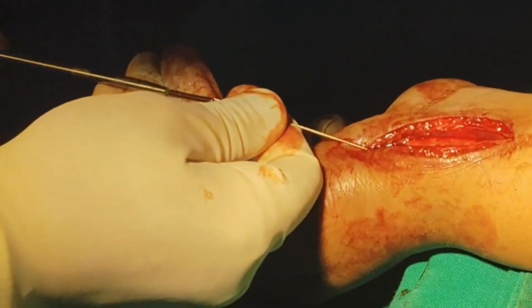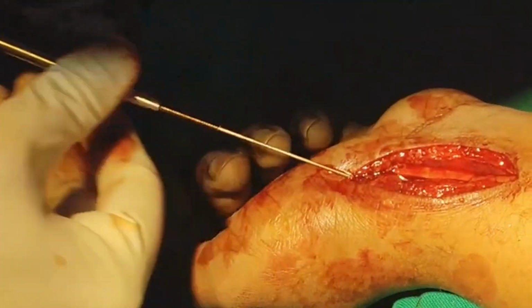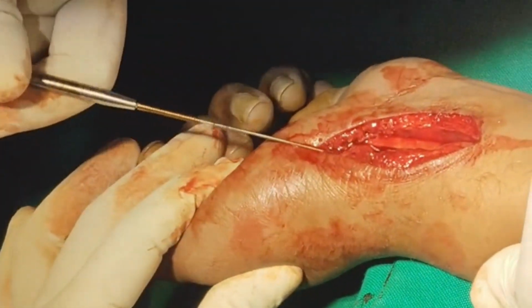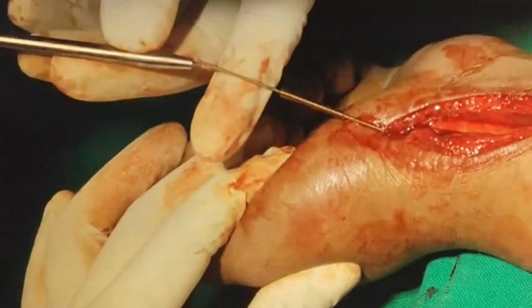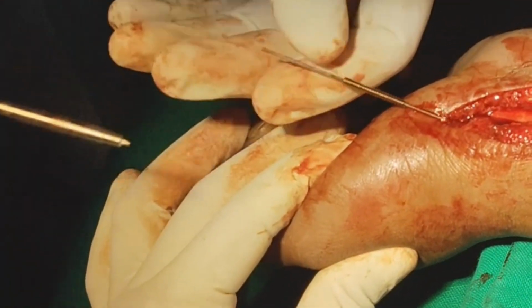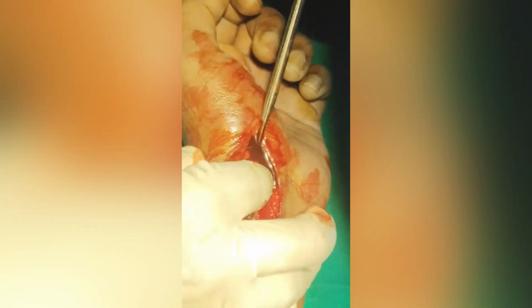After that, I have drilled the bone, and now we are using a 2 mm fully threaded screw, which is not a Herbert screw, it is an Acutrak screw. The Acutrak Scaphoid Screw is a fully threaded, headless, variable pitch compression screw, widely used for fixation of scaphoid fractures. It was developed to provide continuous compression across the fracture while remaining completely buried beneath the articular cartilage.